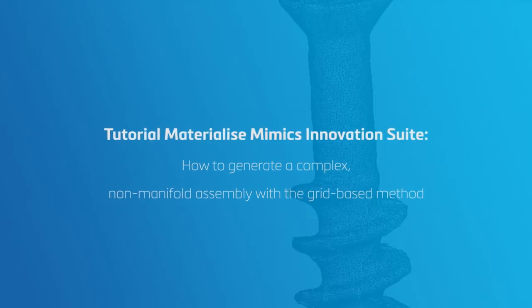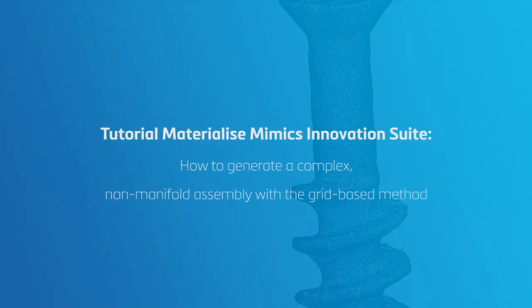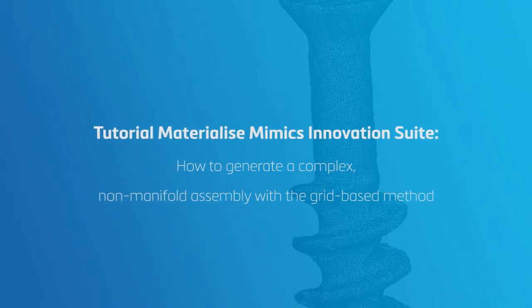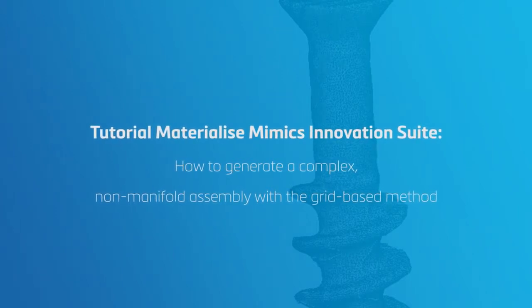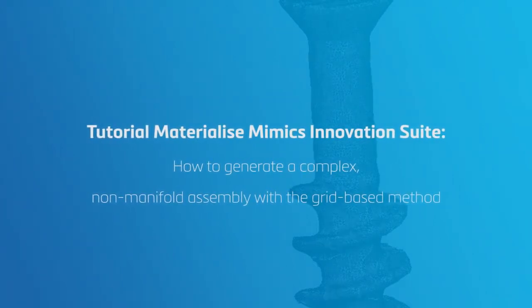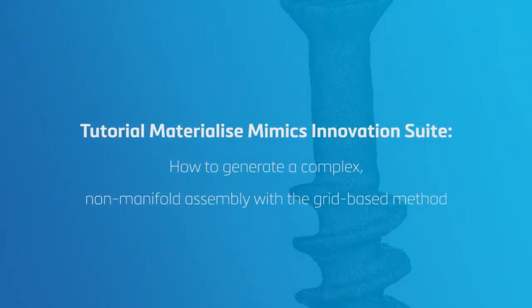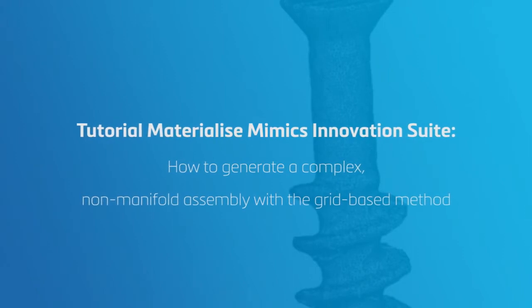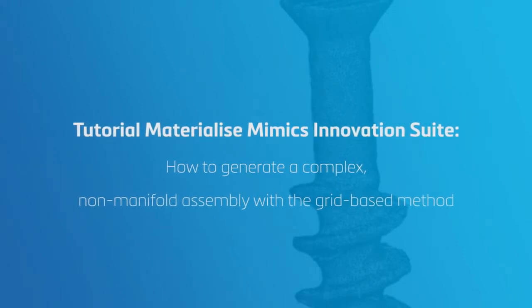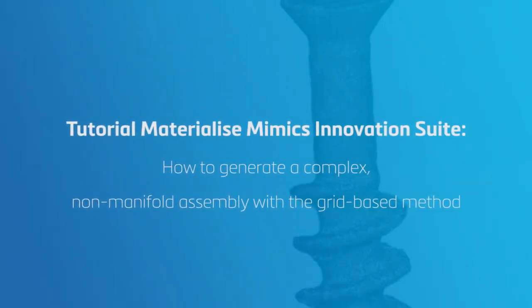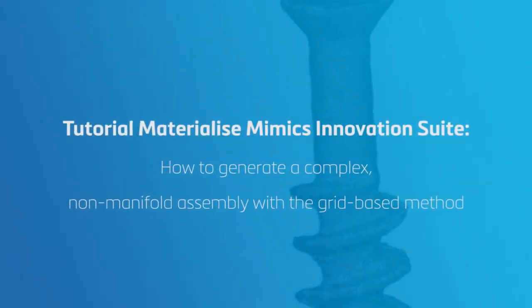In this video, we will show how to generate a complex, non-manifold assembly with a grid-based method in the Materialize Mimics Innovation Suite as an example of an advanced workflow.